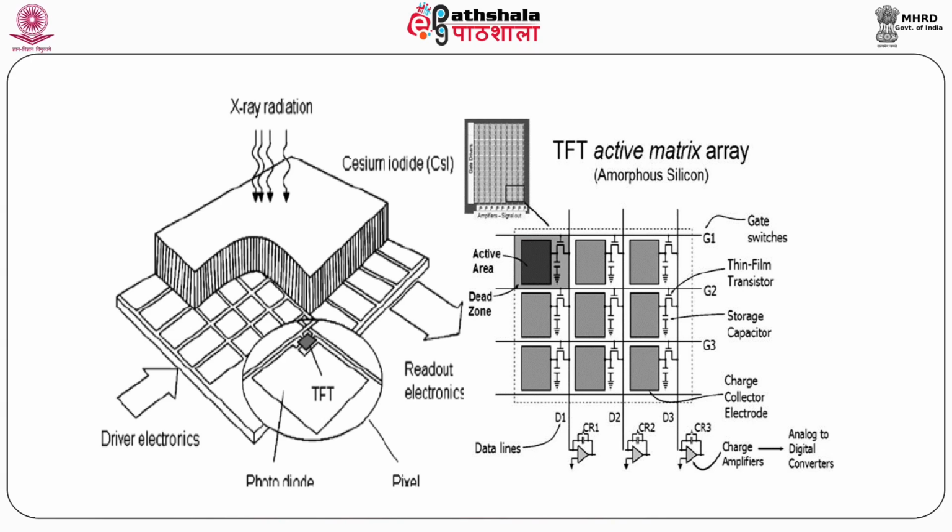Here the doses are comparatively less than conventional X-ray equipment. Digital images do not deteriorate physically or degrade. Images are distributed electronically throughout by web technology. But the disadvantage of DR is that spatial resolution is less as compared to film-screen radiography. Detectors are fragile, requiring careful handling, with high initial cost, and since detectors in digital radiographic equipment are fixed, certain radiographic views cannot be obtained with this technology.